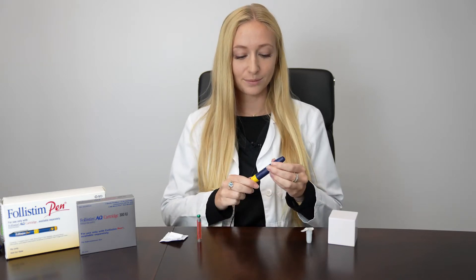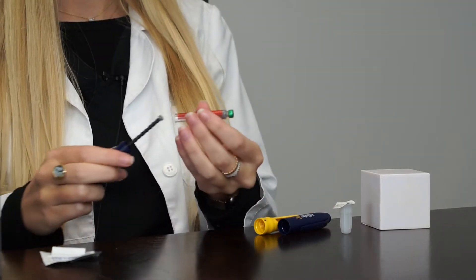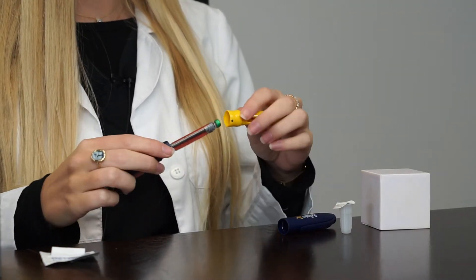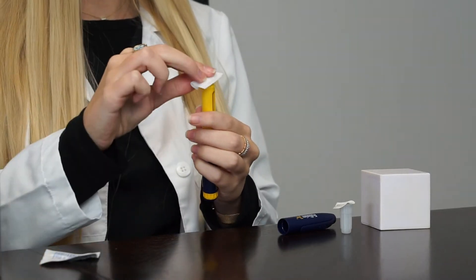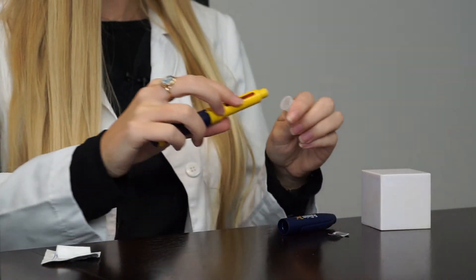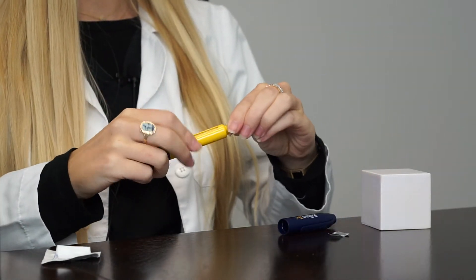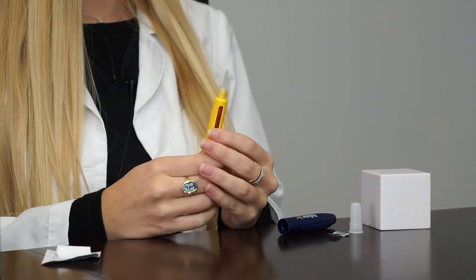To load your pen, pop off the cap and remove the top part. You can then load your cartridge on and screw the top part back on. Wipe the top with an alcohol swab. You can then put on your injection needle by twisting it onto the top. You'll have an extra plastic covering from your needle tip underneath.